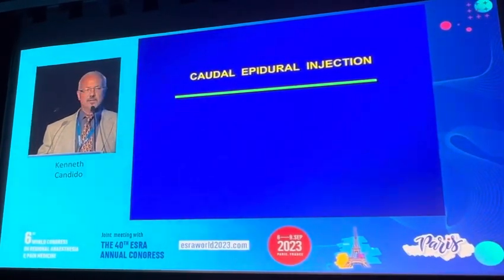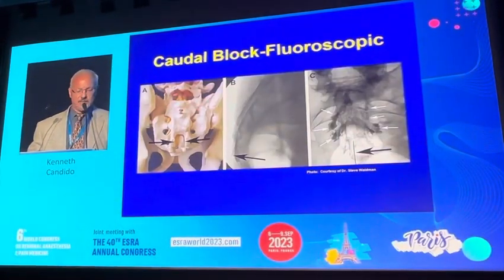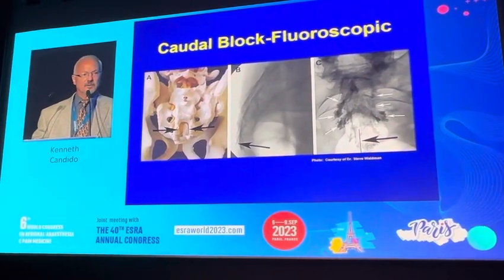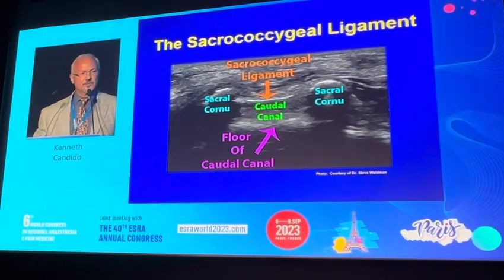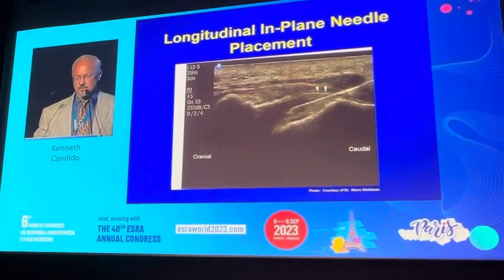Caudal epidural injections, does it make a difference whether we select ultrasonography versus fluoroscopy? Again, the answer is pretty much no. The target here, sacral hiatus at the sacrococcygeal ligament, in trying to place our medication in for the lower sacral segments and possibly the L5-S1 nerve roots, can be accomplished using ultrasound guidance very easily, and it can also be accomplished very easily using fluoroscopy.